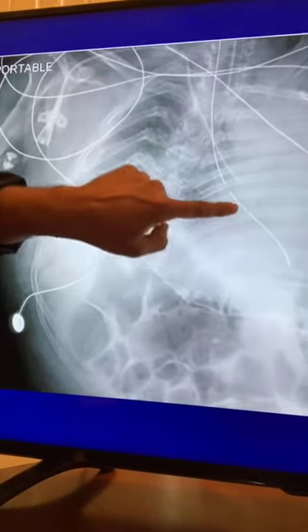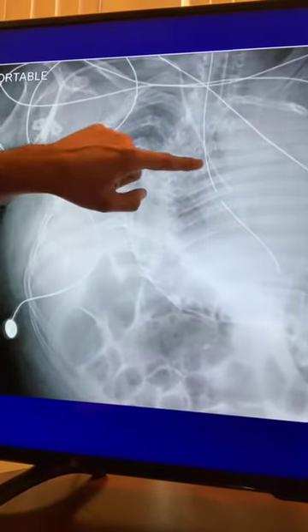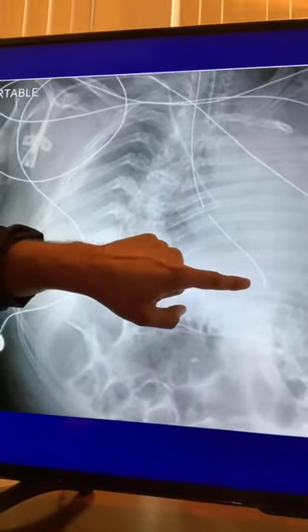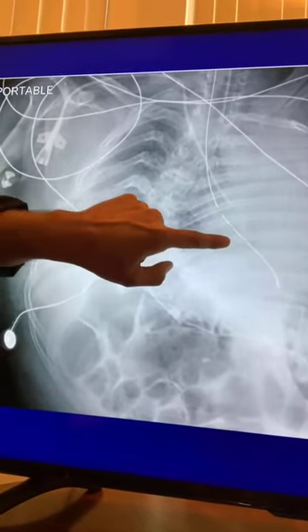Next line and tube that you want to think about. Anybody know what this is right here? This line. Man, I probably have so many fingerprints on my TV here. Who cares, right? Anybody know what this line is? So this is a little catheter, and yes, it always has this break in the catheter right here. Yeah, so this is an NG tube.